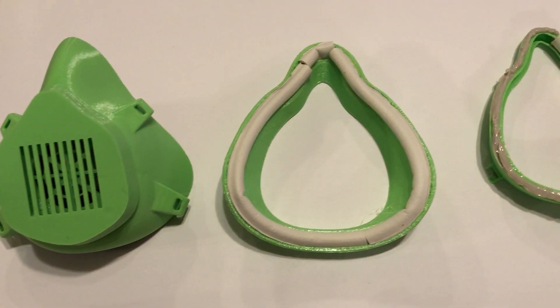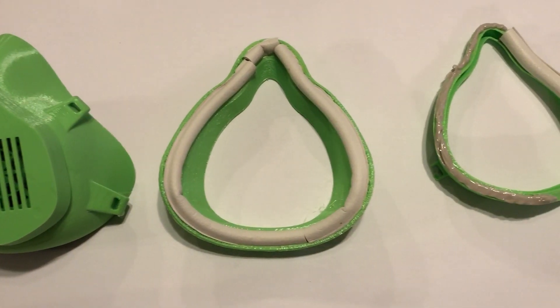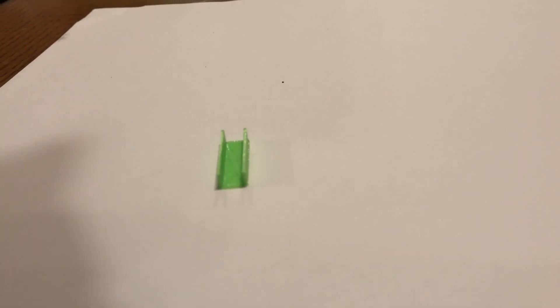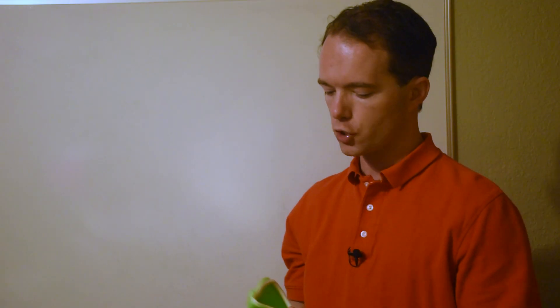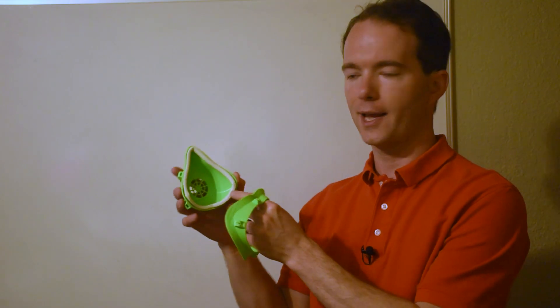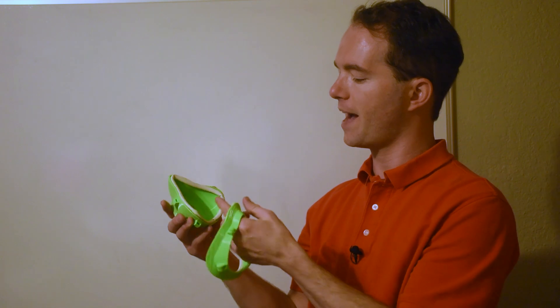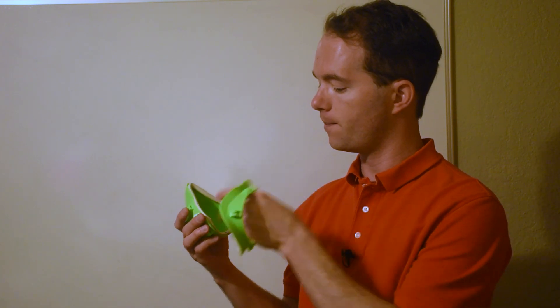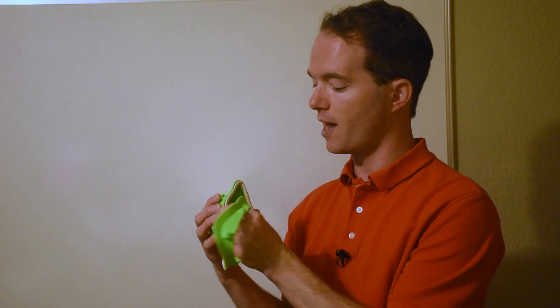I'll show you here kind of what we did. I had some window seal that I experimented with. I first made a bunch of these different little test channels of different shapes and sizes to try to integrate a channel, like I did here, into this mask to fit the seal that we had available.